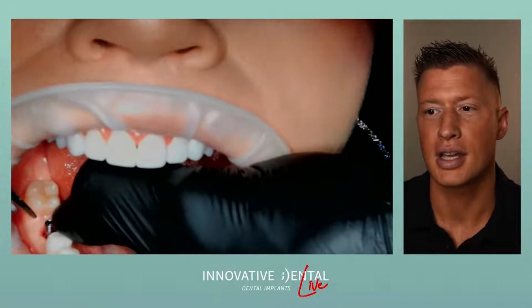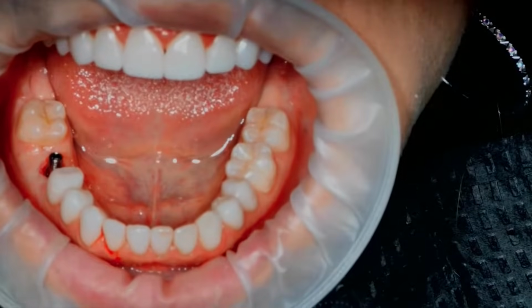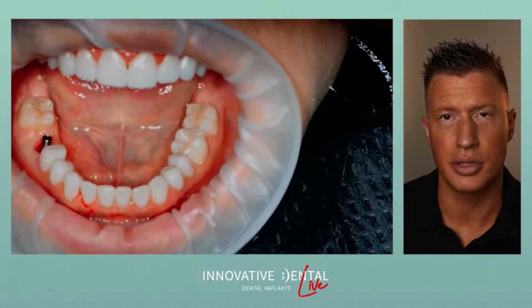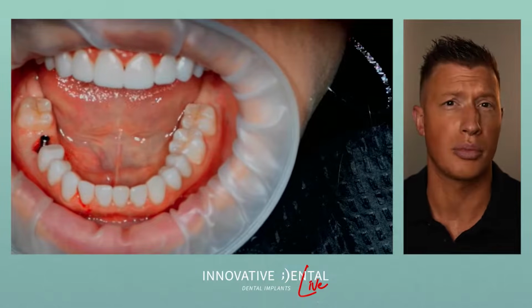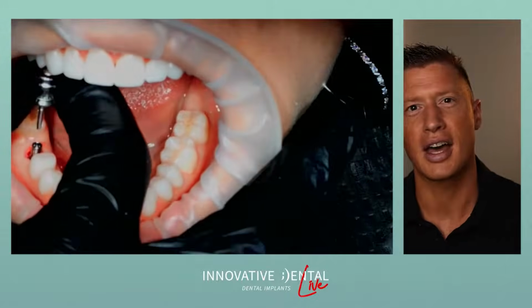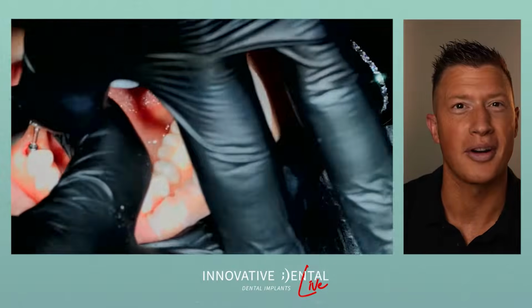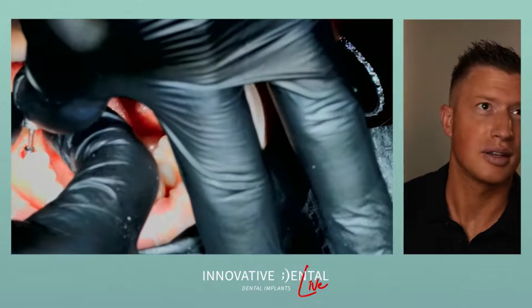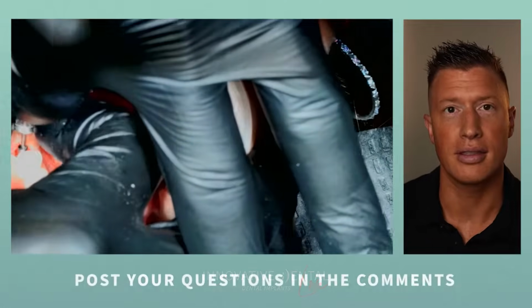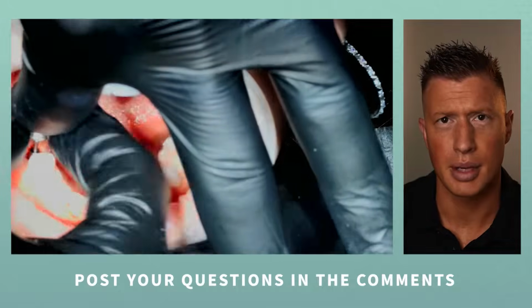So here's the titanium base. That's what you're seeing me snap down inside of that implant. I'm going to tighten that down with this little screw. We do 3D imaging to do all of our impressions, so we don't have to do the gunky impression material. So if you've had a dental implant, you might have had that experience before, or with any crown, honestly. I mean, crowns, veneers, implants, a lot of them are going to be the goop in your mouth. You wait for 3 weeks while you wear a temp.